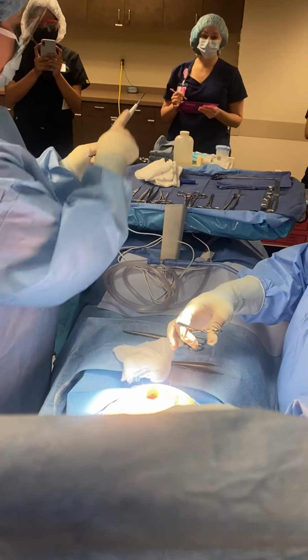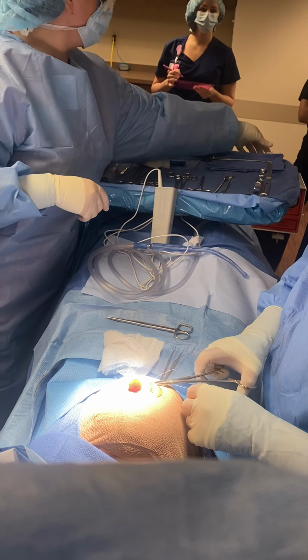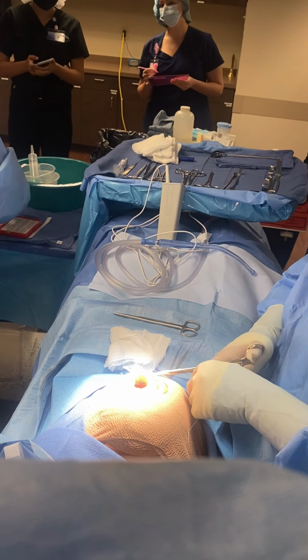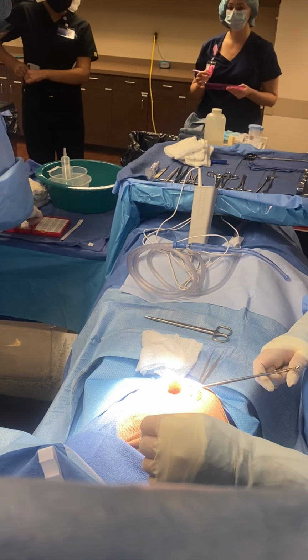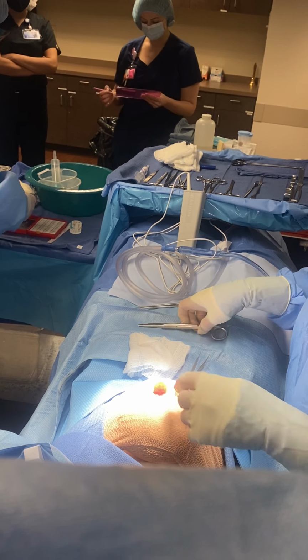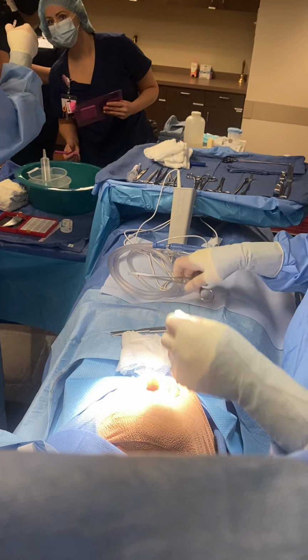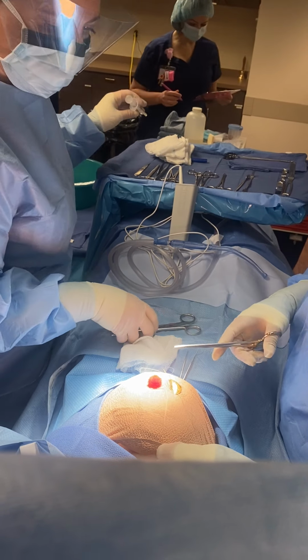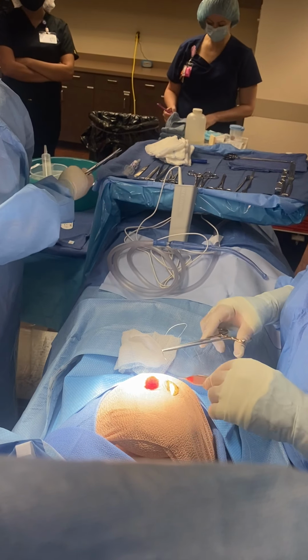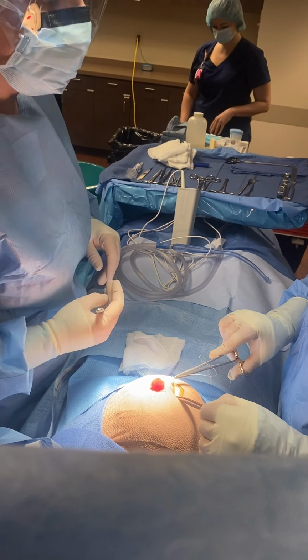All right, Bovie tip, still got one. Stitch, she's using 1, 2, and 3 is still here. Blades, 1 on the mayo, 2, 3, and then 4 is hanging out in there. Okay, 4. Hypos, I got 1 here, and 2. Are you gonna inject more local? At the end. Okay, I'll wait to tell you that then. Did I get everything? And then dressing. Okay, counts correct. Thank you.